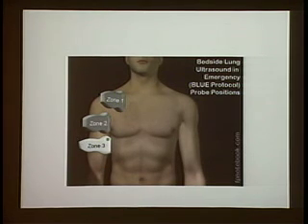And guess what? You can go to upper parts of the lung and lower parts of the lung. So I think if you divide everything in four, it's probably better: anterior, posterior, and then upper and lower. And if you do it on both sides, you're scanning 8 zones of the lung, and that's probably plenty to make a diagnosis. Some authors have encouraged this approach instead of doing up to 28 points of scanning. That's a little bit too much in my opinion.